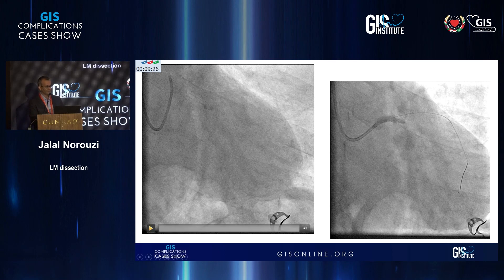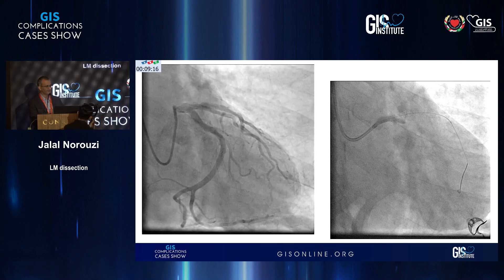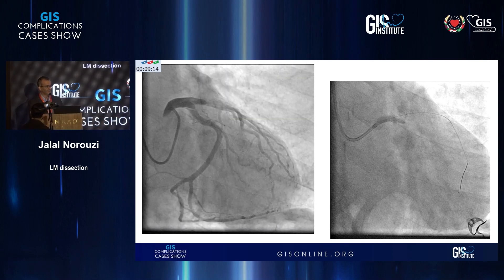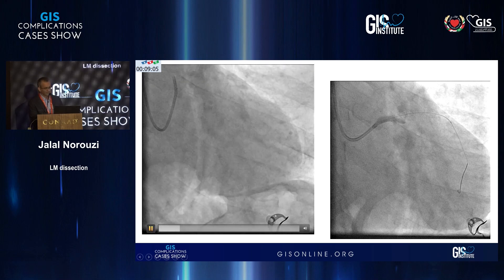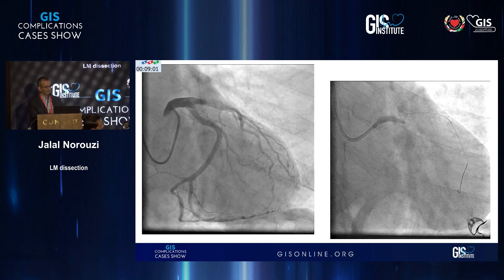Because of the dilated aortic arch, this angio was done by our younger colleagues. The RCA was non-dominant and this was the very first injection after he had difficulty engaging it. As you could see, the catheter is refluxing. It's a diagnostic catheter and as you could see, there's a left main dissection from the very ostium. The good thing was that he stopped at this point.